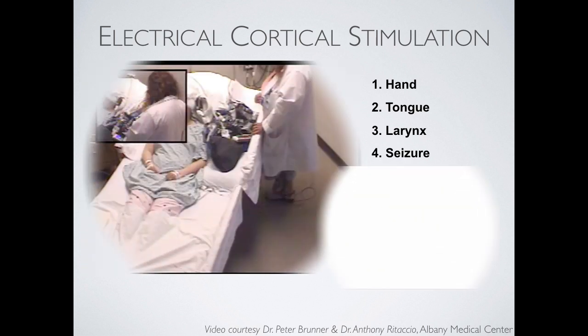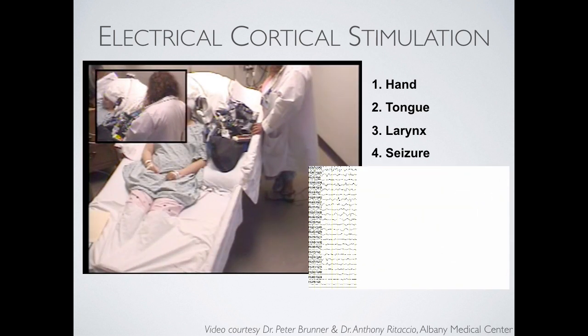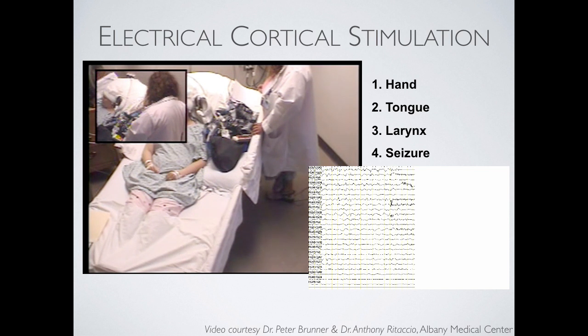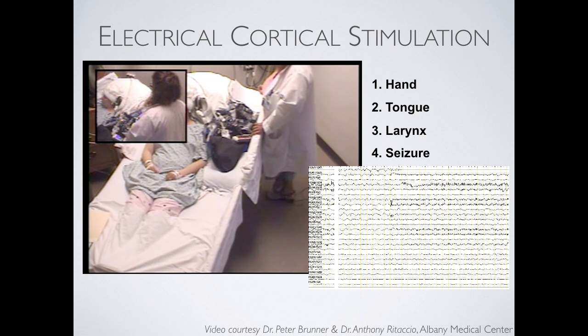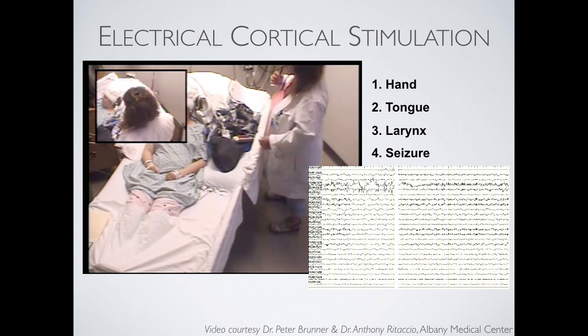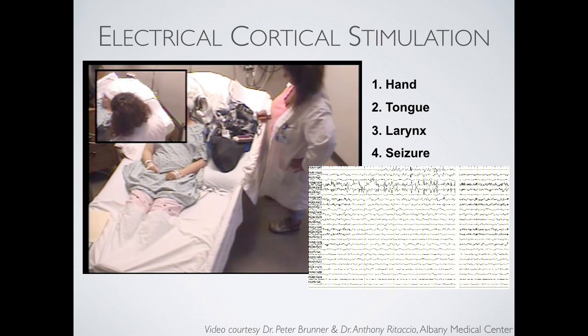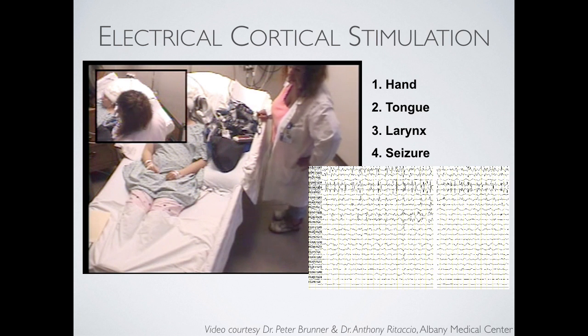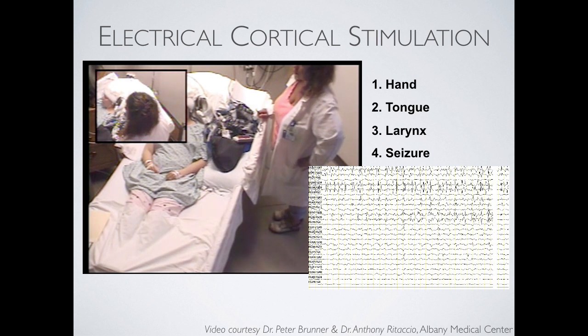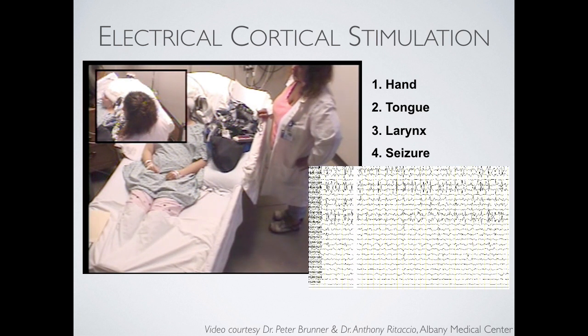So you can already get a sense that this might take some time. And if you have 100 or so electrodes implanted and you have to do a pairwise stimulation for each one, it can take hours. These typically take on the order of 3 to 8 hours, sometimes 2 days. Places like Yale Medical Center implant 200 electrodes.